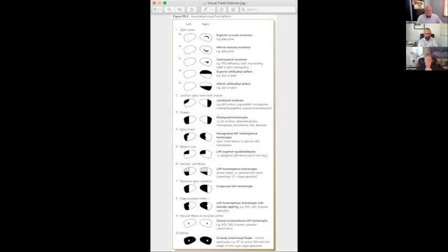There's a lot of variation in terms of anatomy, like Dr. Fanelli said, and those variations are the reason why you can have two completely different defects meaning the same, right? Or two same defects meaning totally different things. So you have to be very careful anyway when you are doing this kind of assessment. And so it's very, very interesting, very diverse.